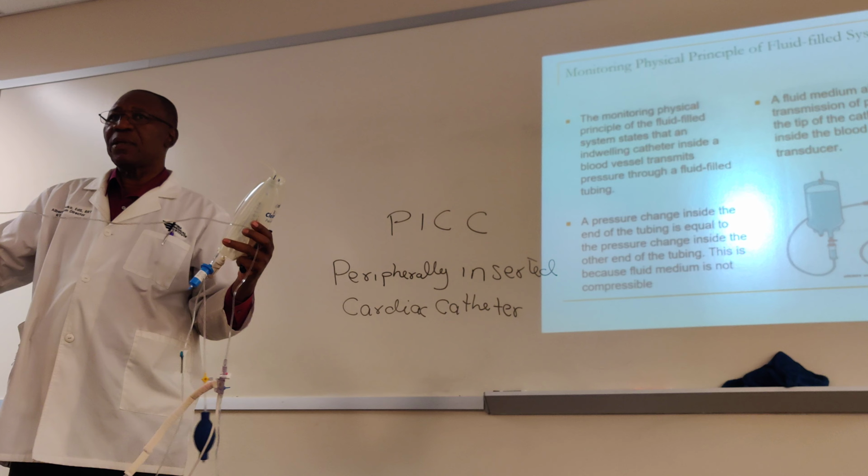So, the monitoring physical principle of the fluid filled system. The monitoring physical principle of the fluid filled system states that an indwelling catheter inside the blood vessel transmits pressure through the fluid filled tubing.